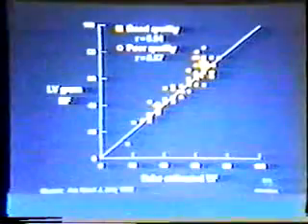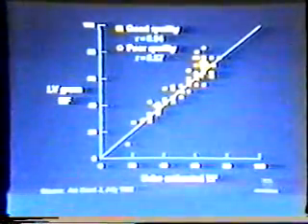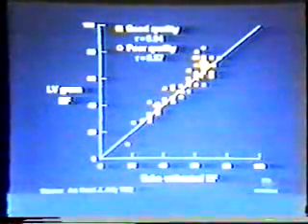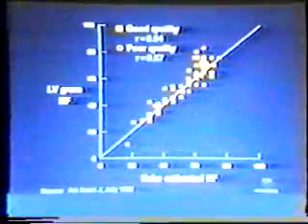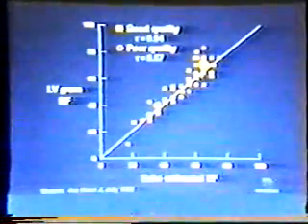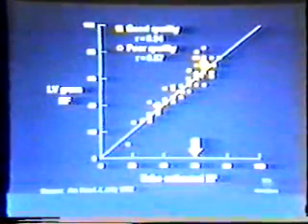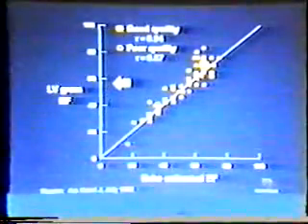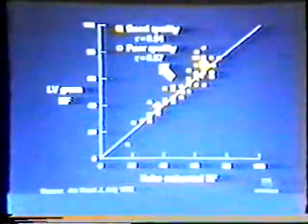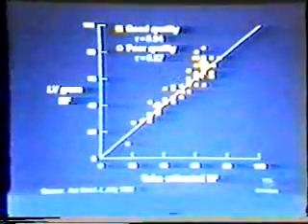In cases when the image quality is suboptimal, we provide a visual estimate of the ejection fraction after evaluating the LV from multiple tomographic views. We actually report a range, such as 40 to 45%. Stamm et al. compared echo-estimated ejection fractions to the ejection fractions calculated from contrast ventriculography. An excellent correlation was obtained even when the images were suboptimal.